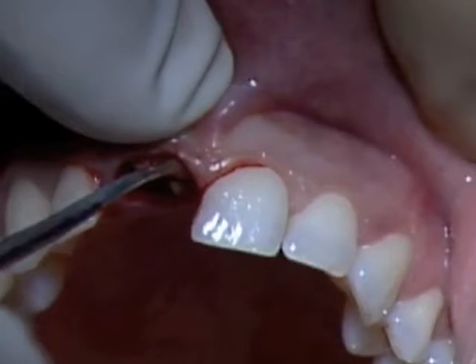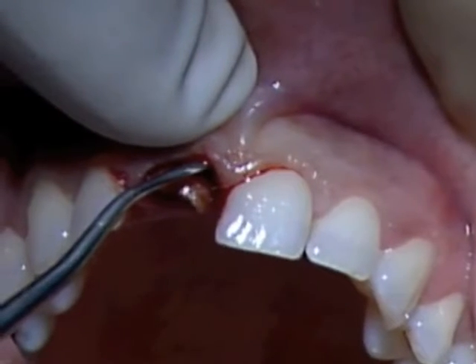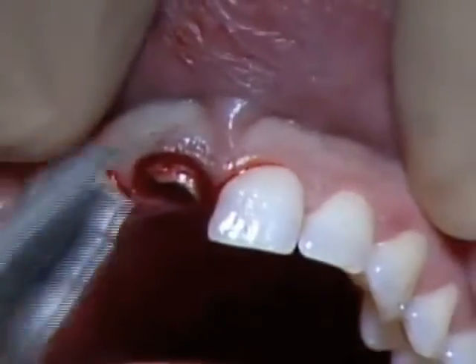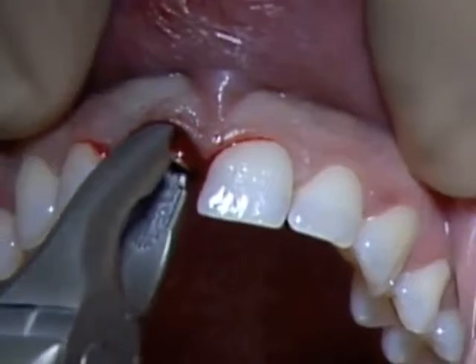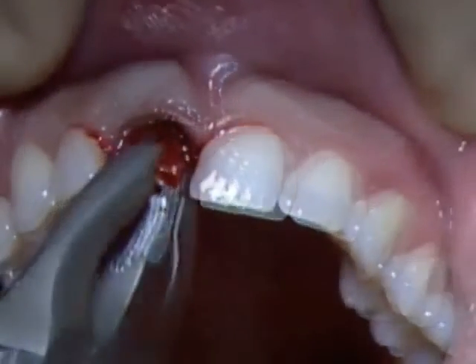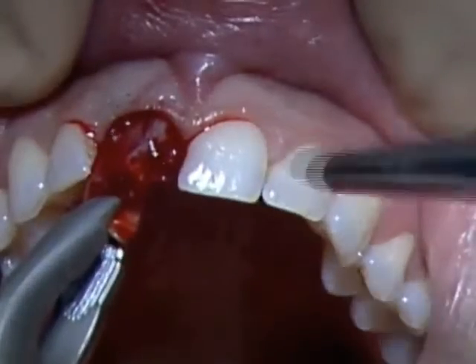After we mobilized it enough, we will use again our forceps, again with elliptical round movements in order not to injure the buccal plate. We see here, while removing it, the defect we have on the mesial aspect.